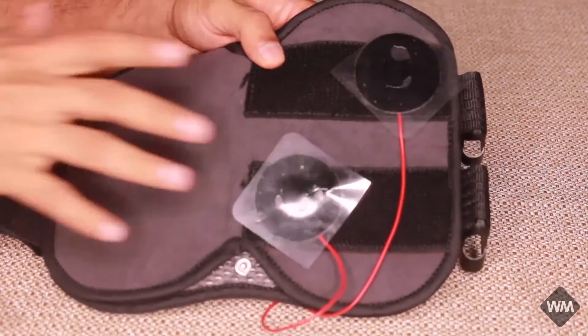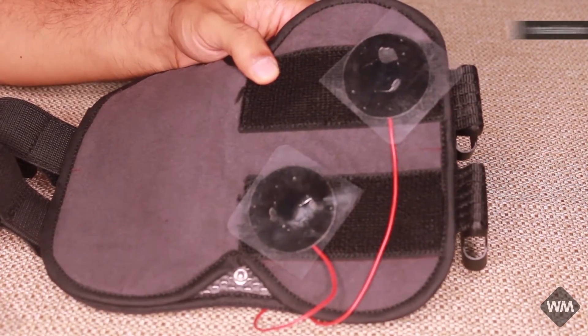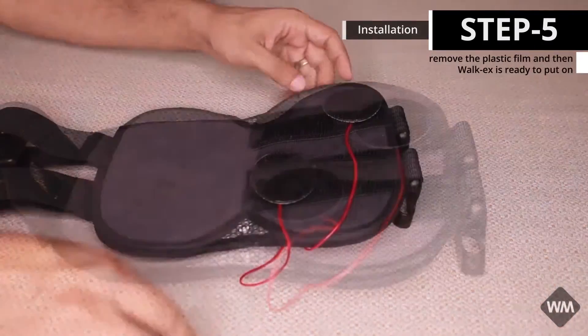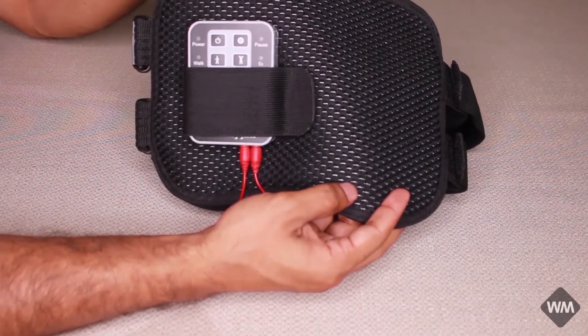Here you can see the larger electrodes placed on the Vokex. Now we are ready to put this on to the patient.